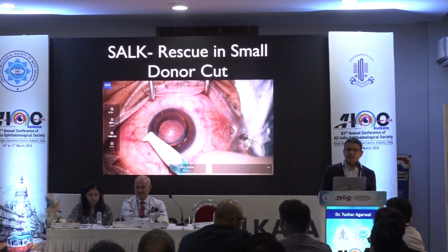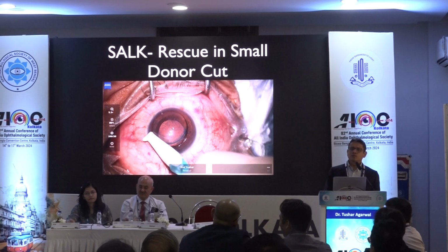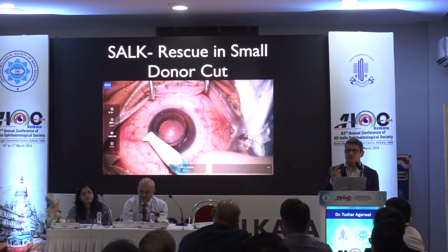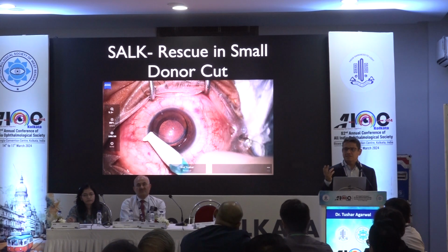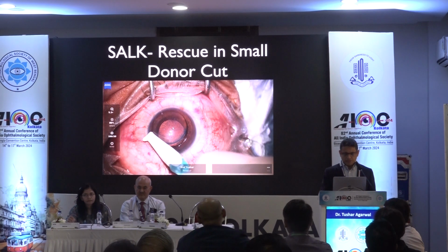The trickier problem was how to manage a smaller graft. One option was to have a backup eye and cut a fresh graft, but generally if the machine on that particular day has cut, say, an 8.5 graft, it will again cut a similar graft even if you try to vary the pressure.